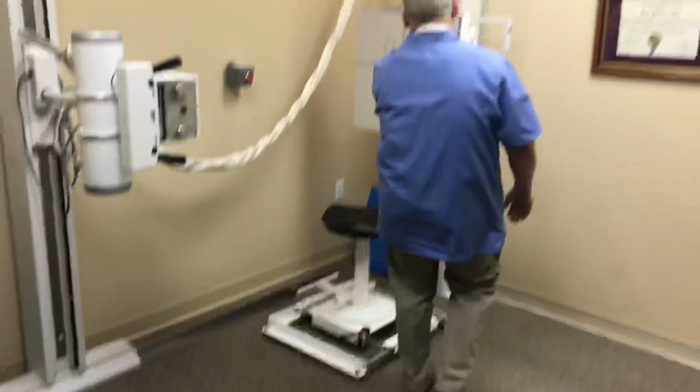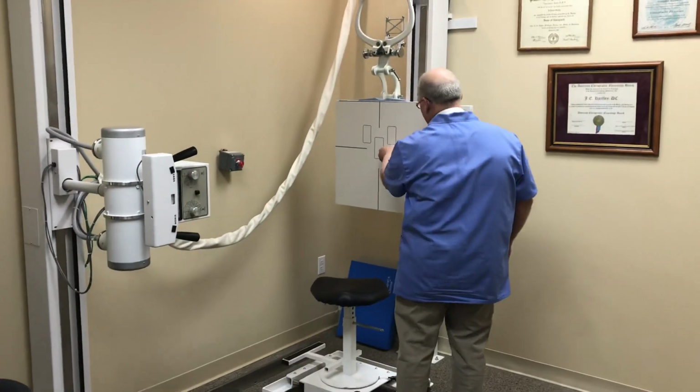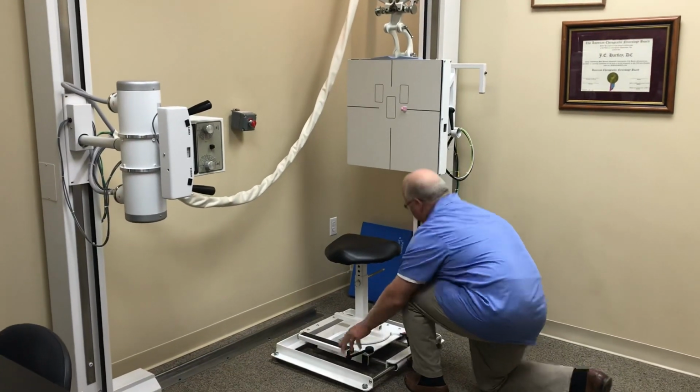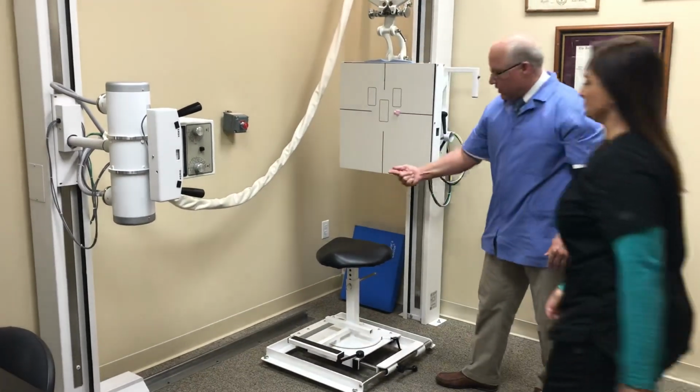Now we're going to go and do the Alar X-ray. So Amanda, go ahead and have a seat here facing this way.